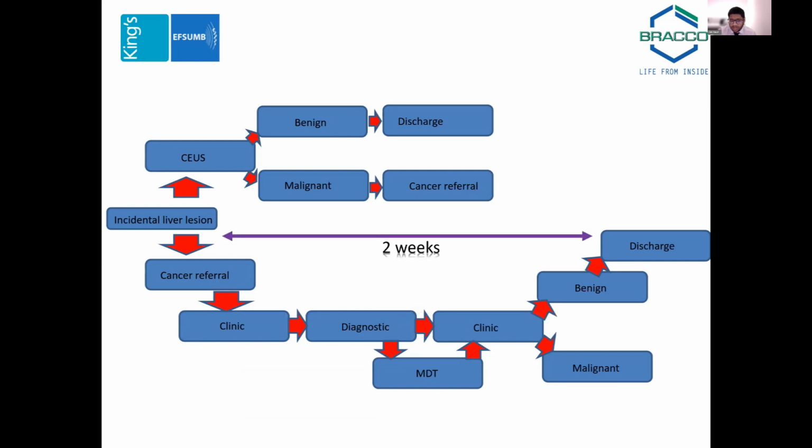What's the difference? Two weeks. Two weeks is what our standards are. That's two weeks of anxiety for the patient, two weeks of anxiety for the operator, potentially thinking, have you done something right or wrong? Two weeks of cost, recurrent visits. It's a lot for a patient to undergo. Compare that to 10 minutes in the room where you have a diagnosis.